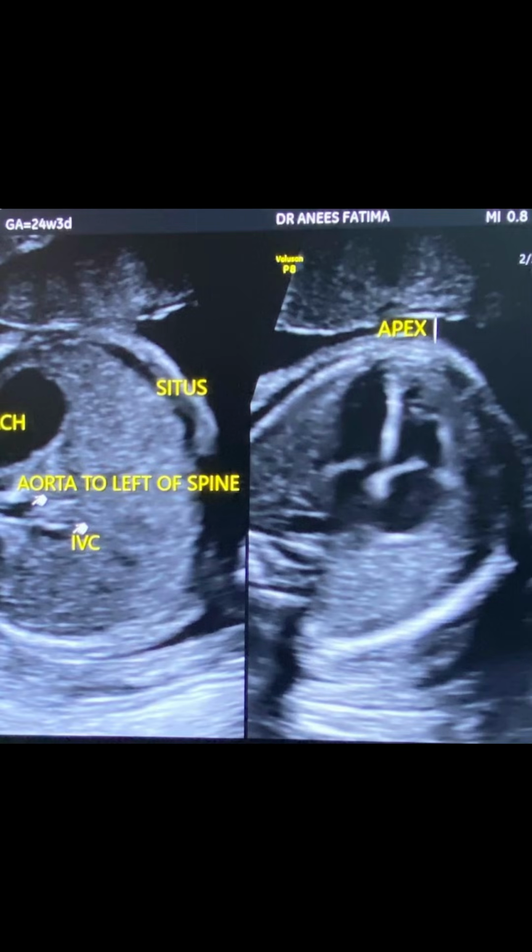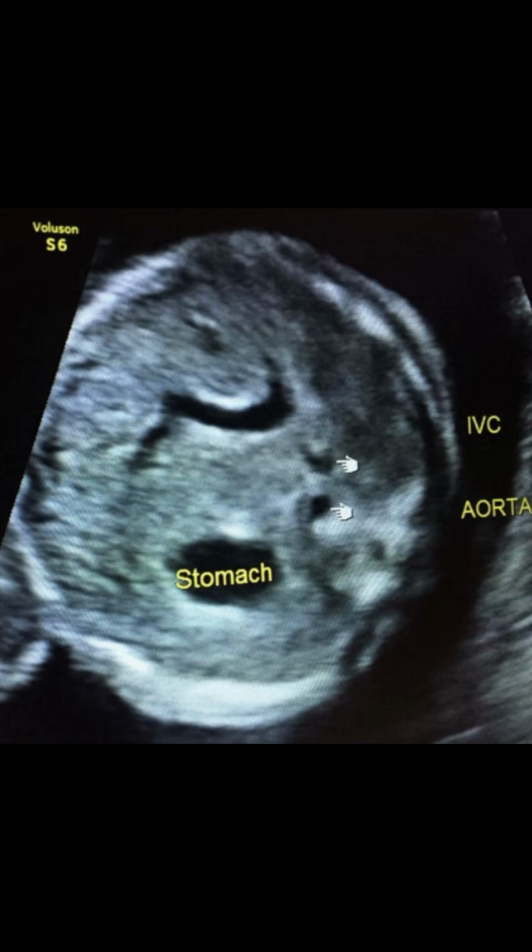In picture 2, note that the heart is pointing normally towards the stomach. It is considered a good practice point to save the dual image of the thorax and visceral situs. Case 1, abnormal visceral situs, can be seen in picture 3.